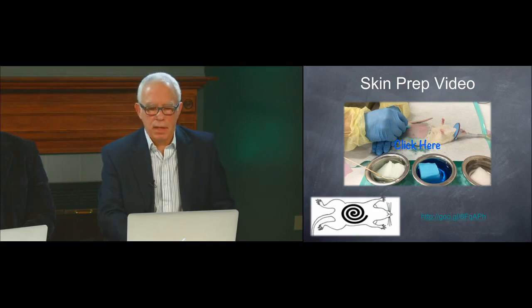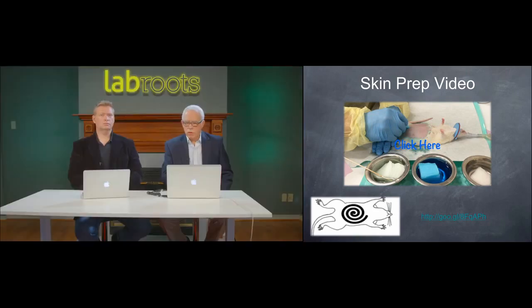But keep in mind here that when you do your scrubbing, you should go, as it will be described in the video, from the center and work your way to the periphery. Many people will do the periphery, go back to the center, and they recontaminate the surgical field. So again, from the center to the periphery. We'll go into the next slide.